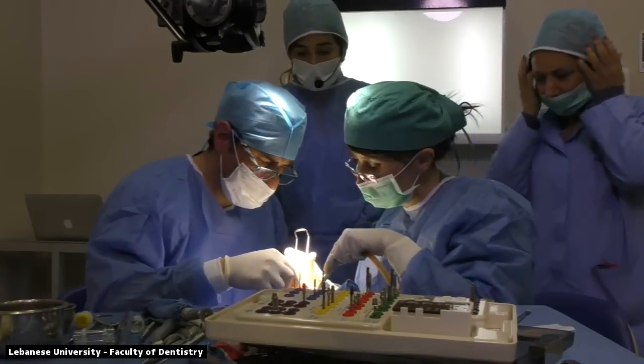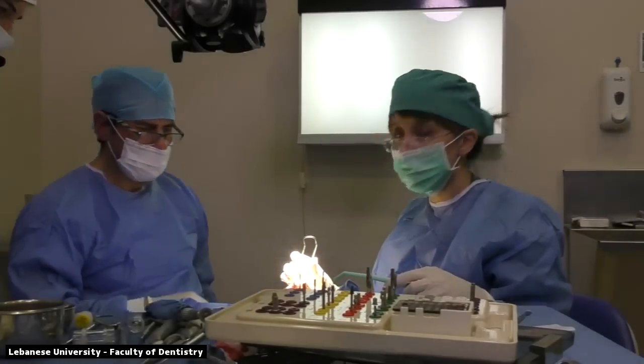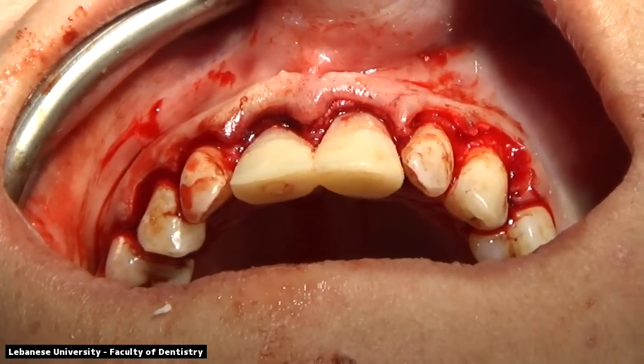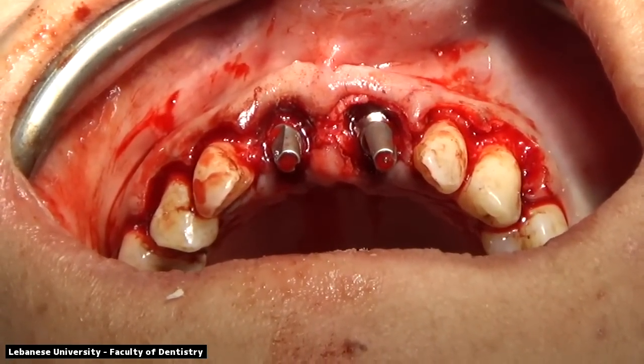Placing the temporary restorations intraoral, and we're looking at the gingival margins. Looking at the emergence of those two crowns with the occlusal surfaces of the neighboring teeth. And you can see that we have a proper aesthetic appearance, proper emergence profile, and we have sufficient space for the interdental papilla.